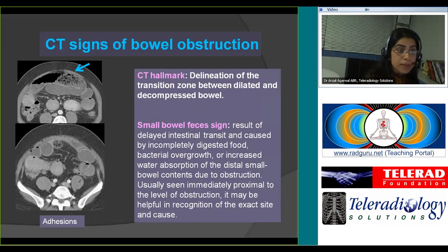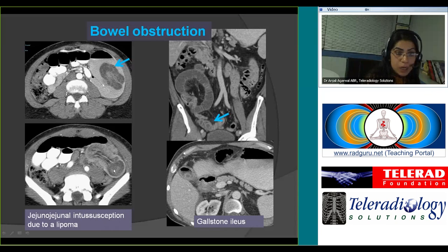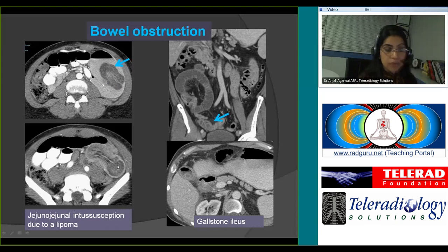In this case there is small bowel obstruction with a small bowel feces sign as a result of adhesion — you can see the abdominal wall scar. Another cause of intestinal obstruction is intussusception: this patient had jejuno-jejunal intussusception — notice the bowel-within-bowel appearance. In small bowel intussusception in adult patients, look for a lead point. This patient had a lipoma acting as a lead point.